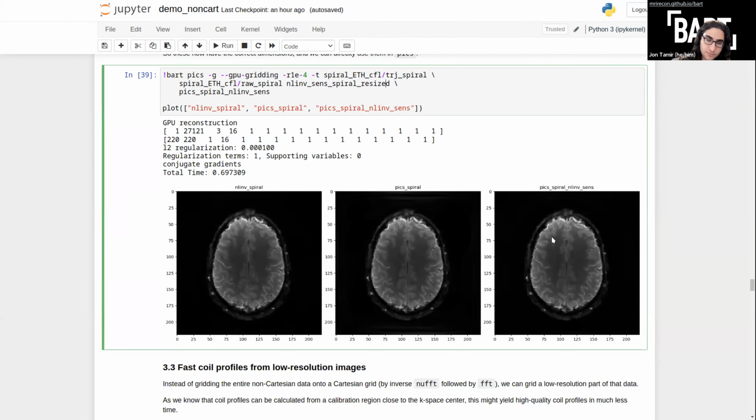In principle, though, you could add those in, or wouldn't it be compatible with the algorithm? Oh, we can add them in. I mean, what NLINV does basically is take the nonlinear problem and linearize it around one point. Then you could add the regularization to this linear problem, get a new estimate, linearize again. So we can do that, and we have done that before, and we are going to implement it properly soon.